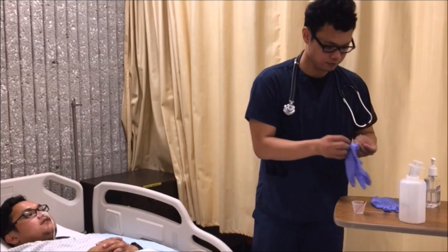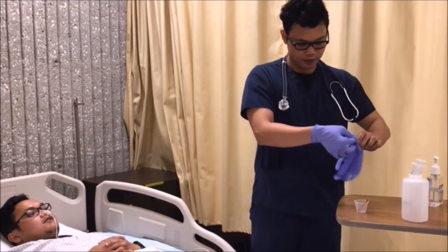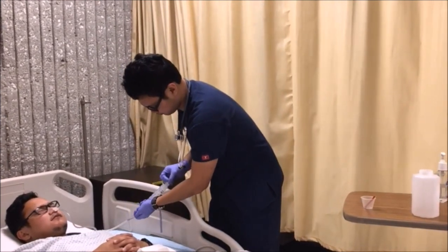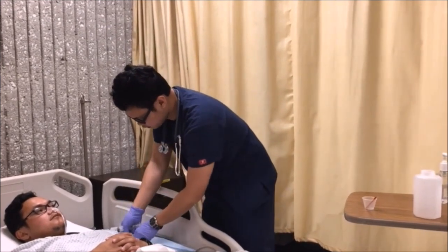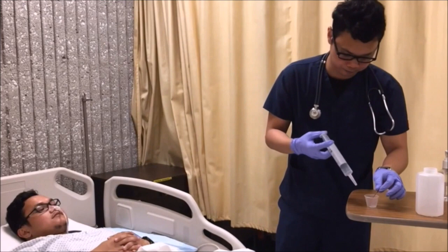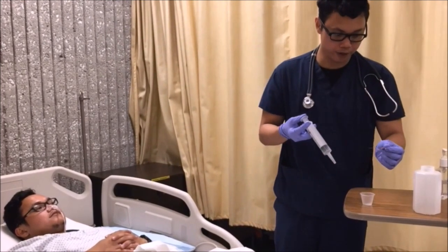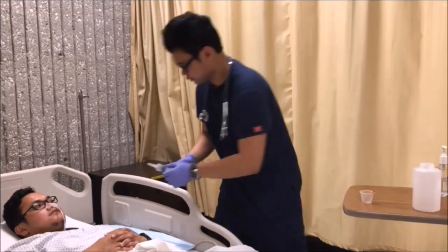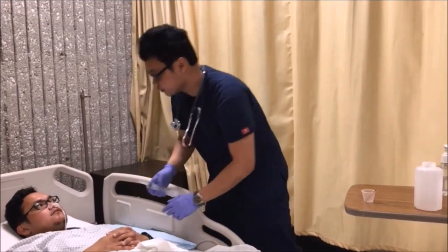Alright, so I'm going to aspirate some gastric contents from your NG tube to see what we can get. Alright, so it looks like we have some output here. Let me just double check on the litmus paper — just a little bit there. It turned pink, so it means we're good. It's acidic. Alright, I'll come back to give your medications, okay?